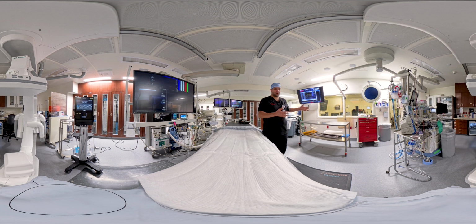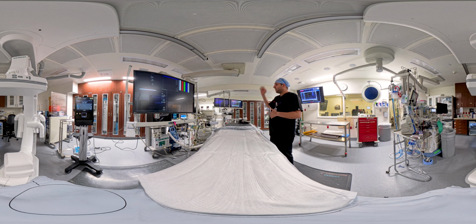Over here is the table where we will have our equipment that I will use for the procedure. Across the room, we have many monitors that we use for pacing or for inducing arrhythmias. That is behind that TV. We have extra monitors over here and extra monitors behind me.